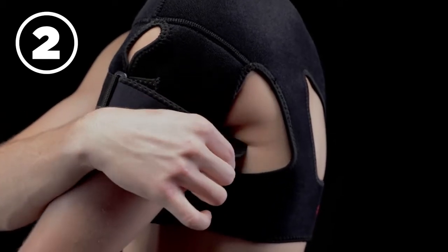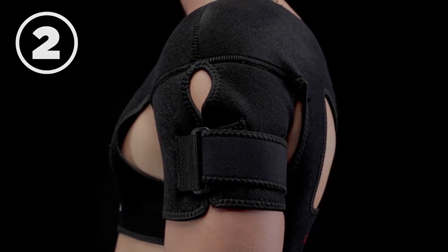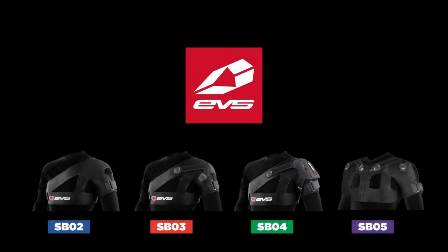Then, tighten the arm strap to a comfortable level to prevent underarm chafing and mitigate brace movement. Check out our entire line of shoulder braces at evssports.com.